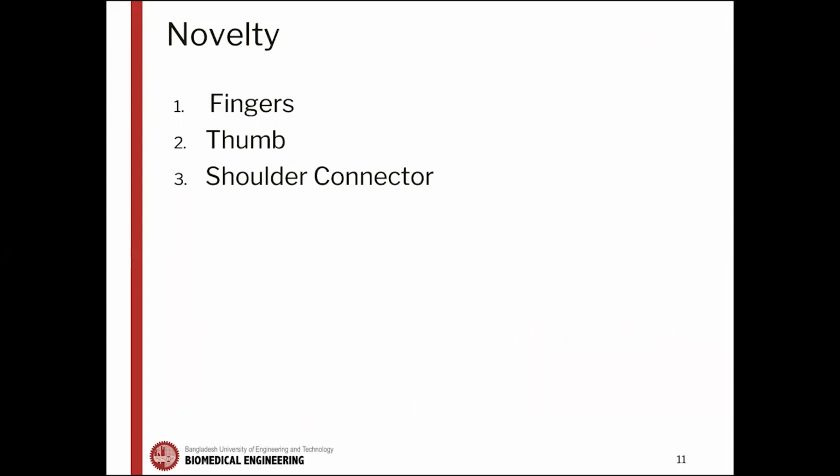For the thumb design, we had to consider the movement of the thumb in the lateral direction of the palm, because of which the angle of the wire will be acute and the friction will be great. So we decided to reduce the angle of the wire by passing it through the farthest channel.